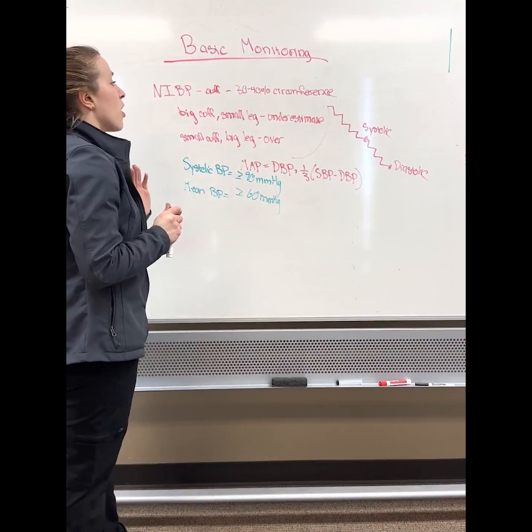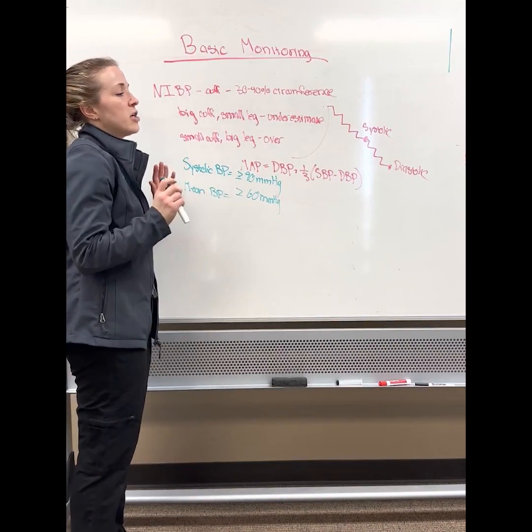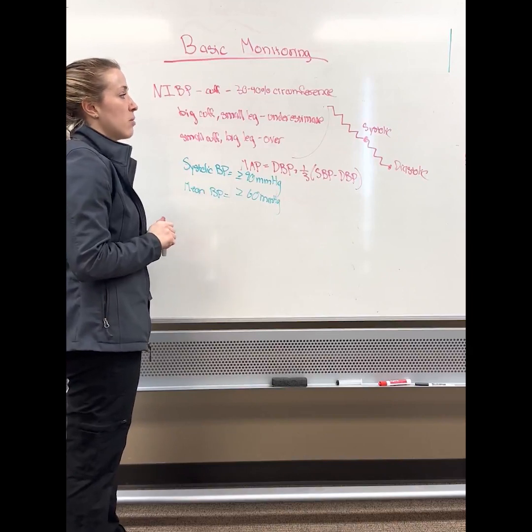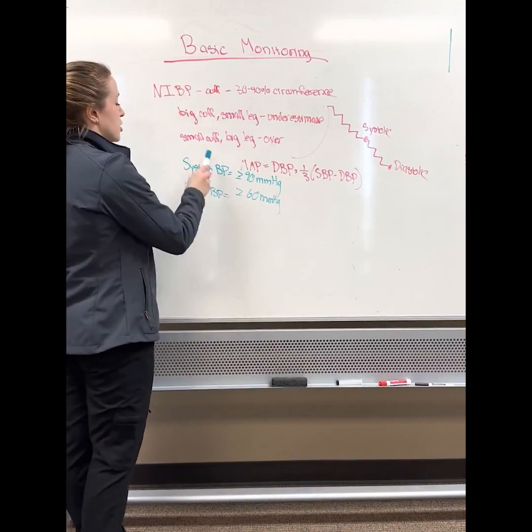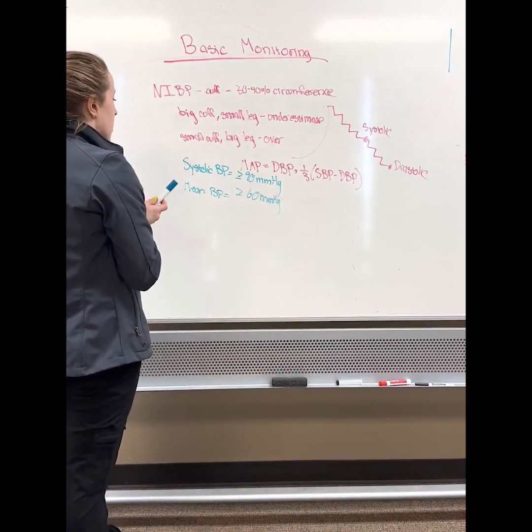There are consequences of hypertension, which I will discuss later, but that is not usually a complication we see in animals, at least when they're anesthetized. Hypotension is much more common. So that's what I can say about non-invasive blood pressure.